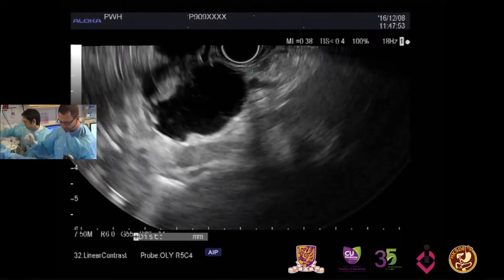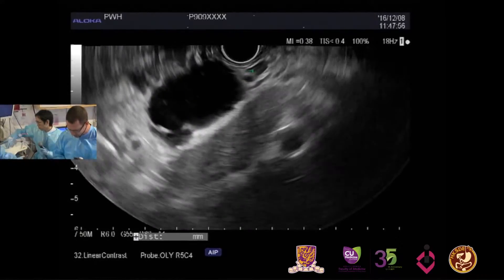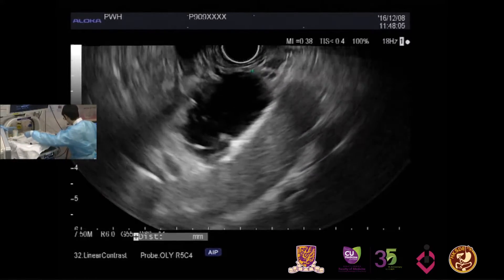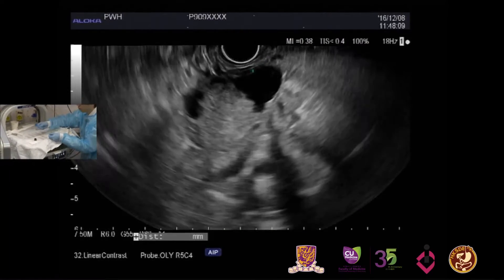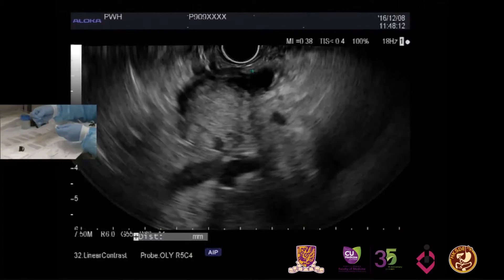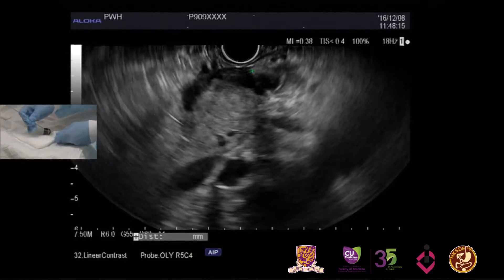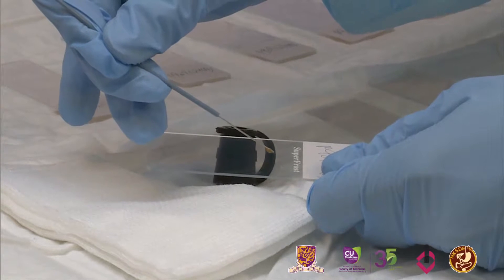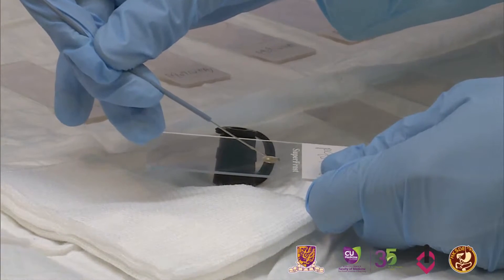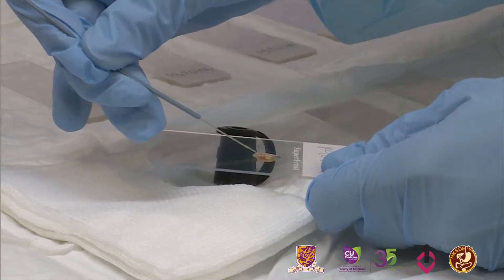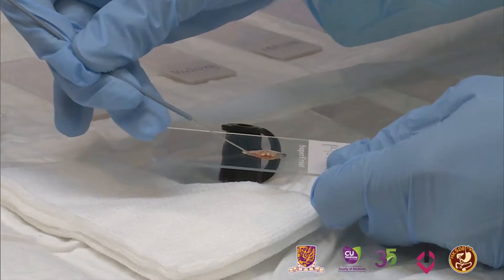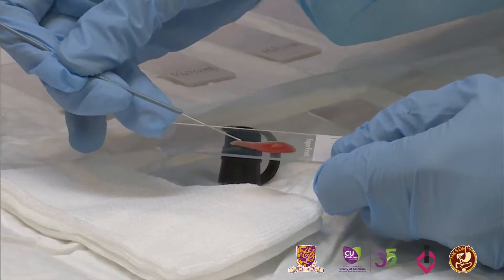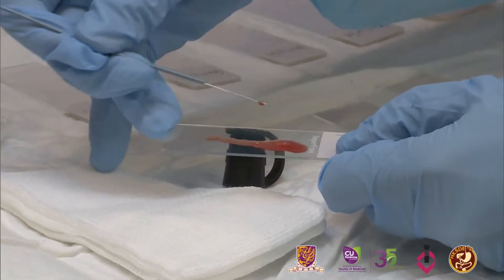Raymond has already prepared some slides. We'll go ahead and make a couple of slides. Could you guess what the tumor might be? It's unusual. Well, there's a cystic component for sure, so I suspect this is a malignant degeneration of a cystic tumor. In a female, in the tail, it's most likely a mucinous cystadenocarcinoma. It could also be an IPMN. Measuring the tumor now — it looks to be about 3.3 centimeters.